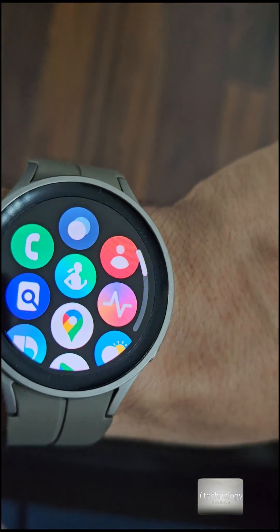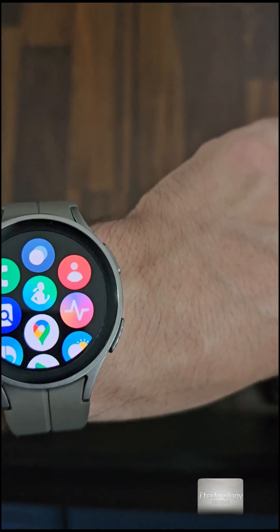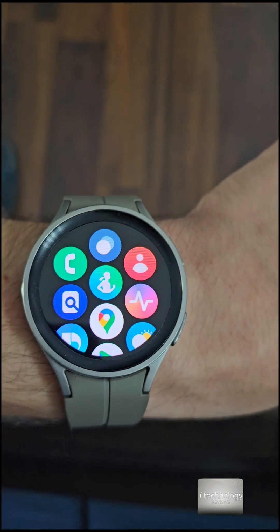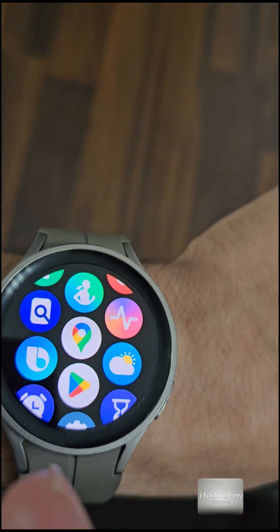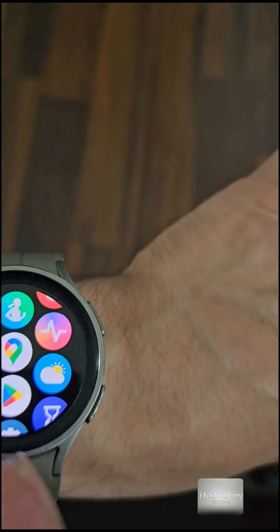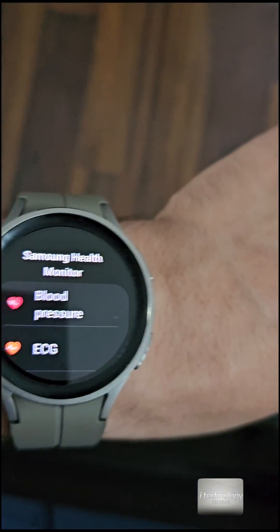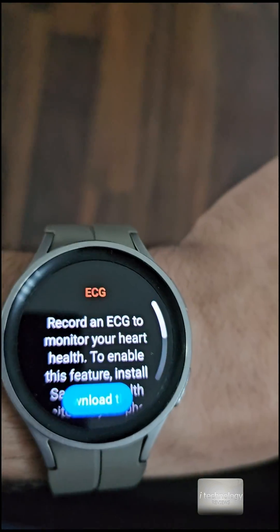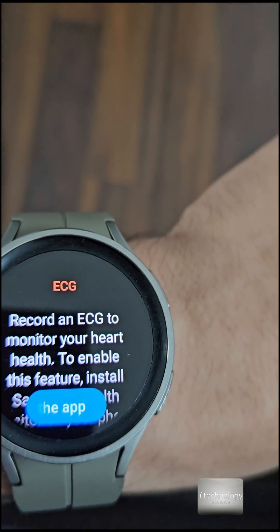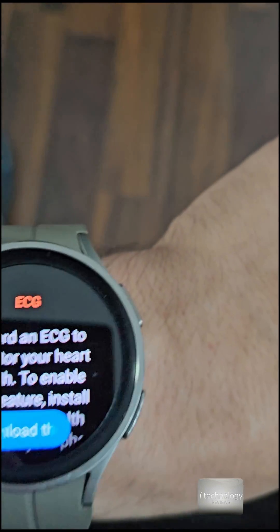Let me show you on the watch what you have to do to install it on your phone. Slide over and you'll see it here — it's installed by default on your smartwatch. If not, you can use Google Play from your smartwatch to find it. Click it — it's called Samsung Health Monitor. Select ECG, for example, and it will direct you to install it on your phone.